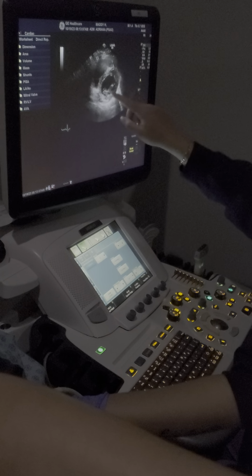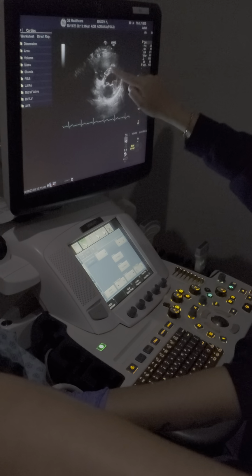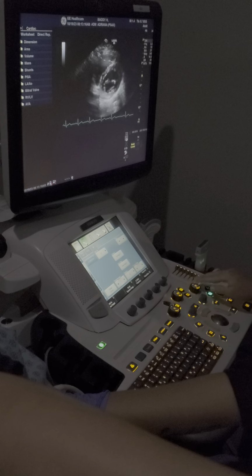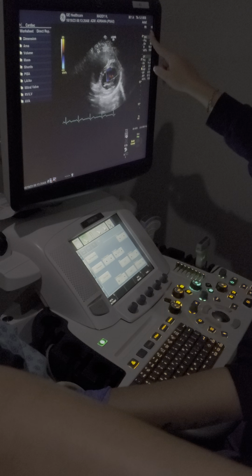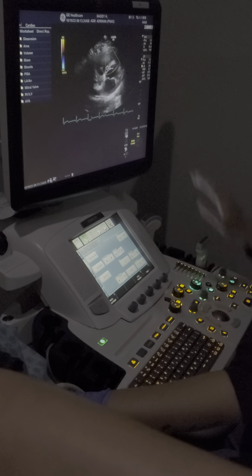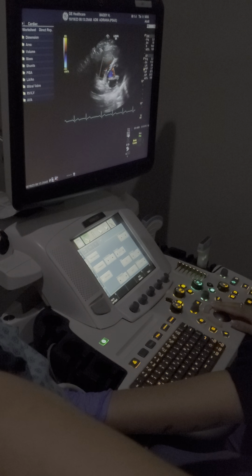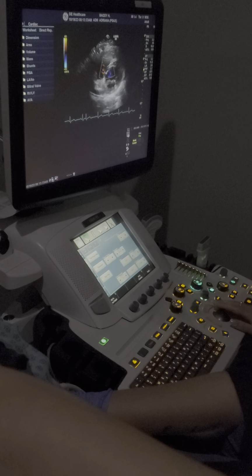So in this picture, this is mitral valve. The circle part here is LV, right? Right. This is the septum. This is RV. Okay? So you're gonna put color over the septum here. You'll have to break it up into two. See how low my frame rate is? So break it up, make it really small, get your frame rate correct, and then do one here, and then move it down over here. This looks for ventricular septal defects, holes in the septum, okay?